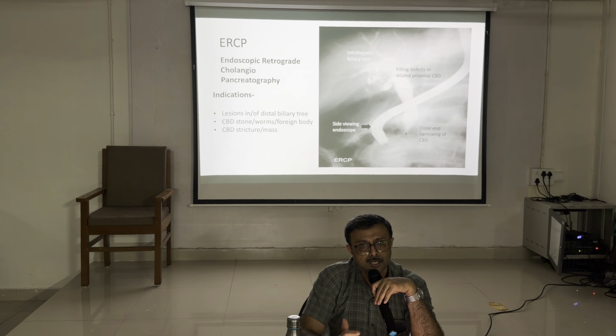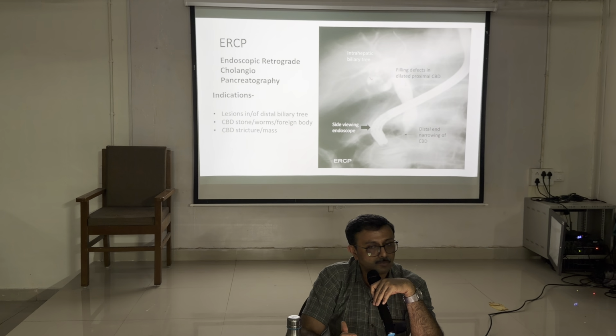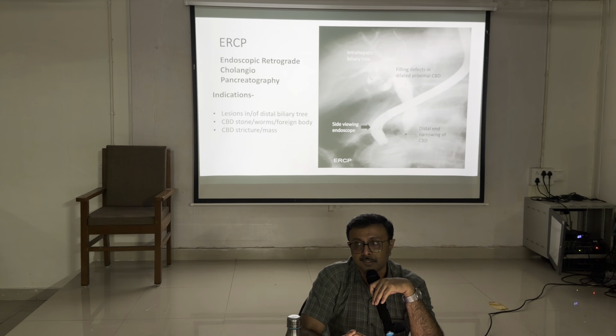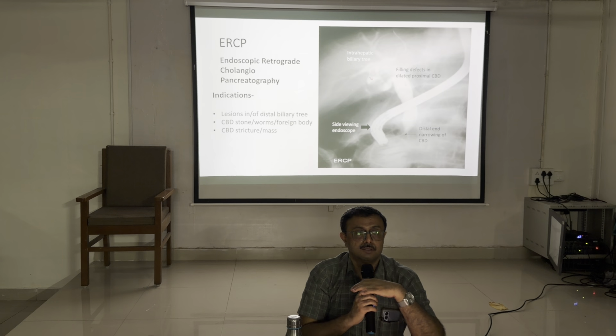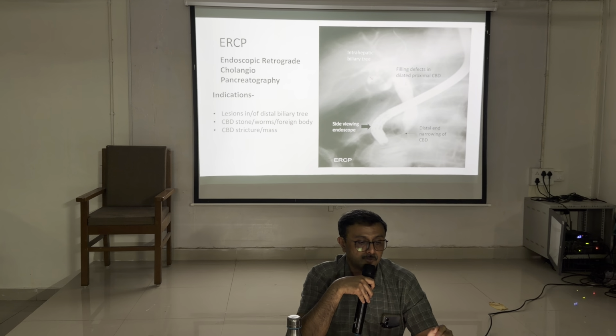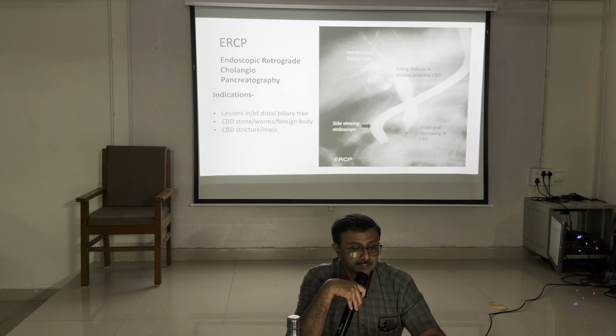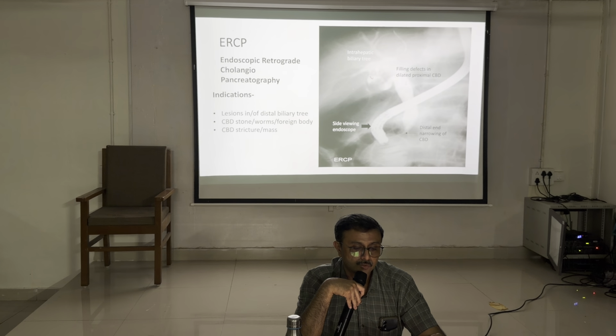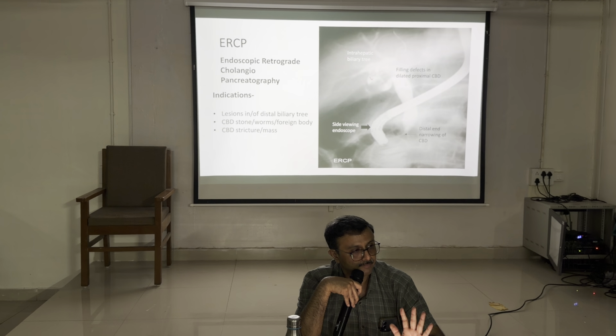ERCP, endoscopic retrograde cholangiopancreatography, is a very classical diagnostic as well as therapeutic procedure. The advantage of ERCP over MRCP is that it is simultaneously therapeutic. We can take a biopsy, and we can put a stent. Indications are distal biliary or CBD stone, worms, foreign body, CBD stricture, mass, and obstructive jaundice.